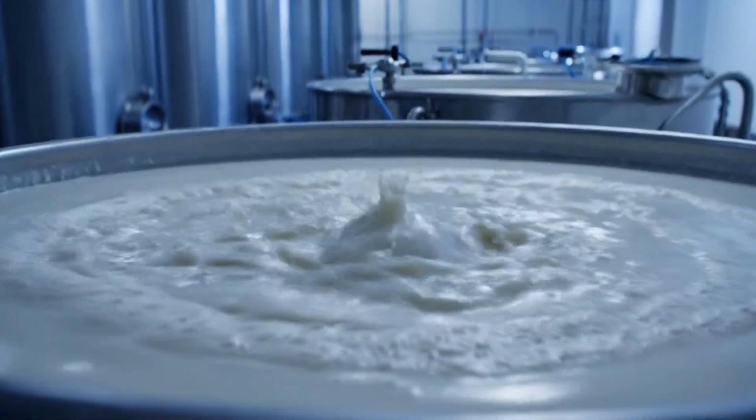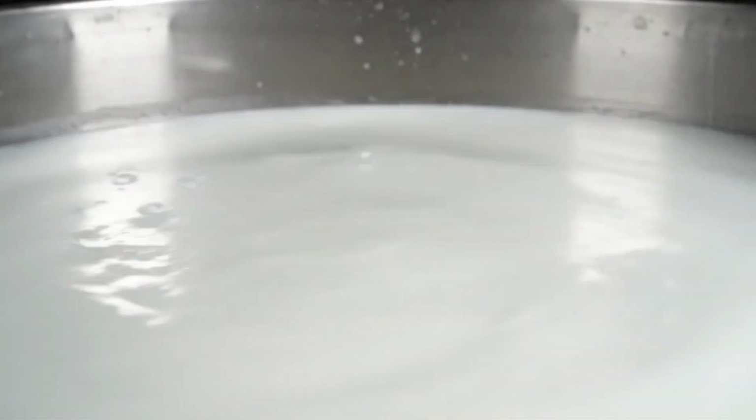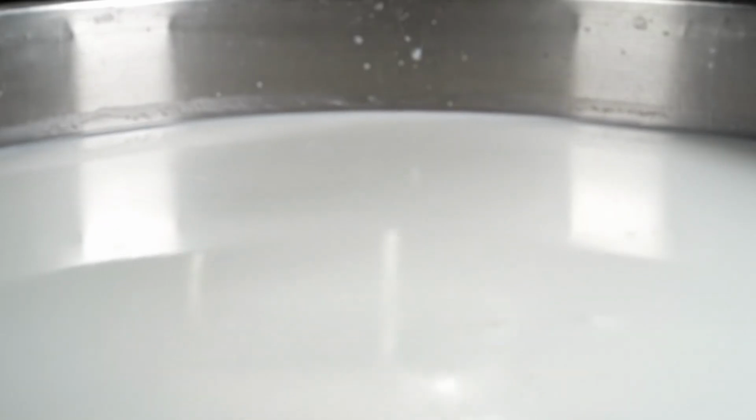Patience is part of the process. The latex must rest so the chemical bonds can fully mature. An air bubble in the liquid means a hole in the condom. De-aeration is our first line of defense against defects.